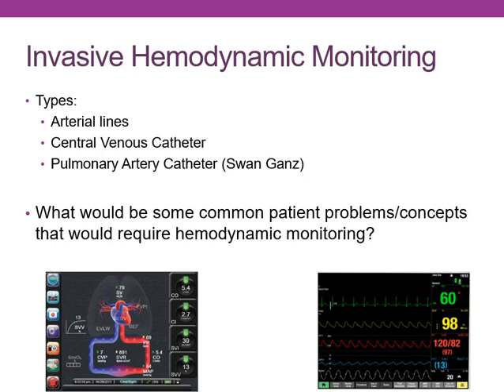All right, let's continue on. We're going to talk about invasive hemodynamic monitoring and specific arterial lines. So, a couple of different ways we can do invasive hemodynamic monitoring, arterial lines.